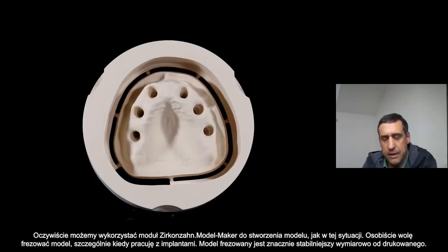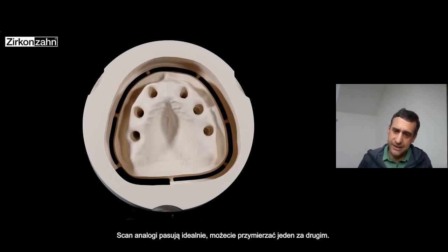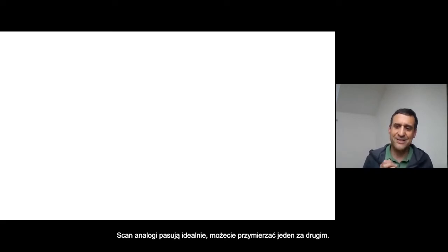Of course we can use the model maker to create models — in this case I was creating and milling the model. I prefer to mill models when possible, especially for implants — not to print but to mill. It's much more stable when you want really high quality models for implants. The scan analog fits perfectly one in the holes, one by one — same fitting for each, like you can see in this case.